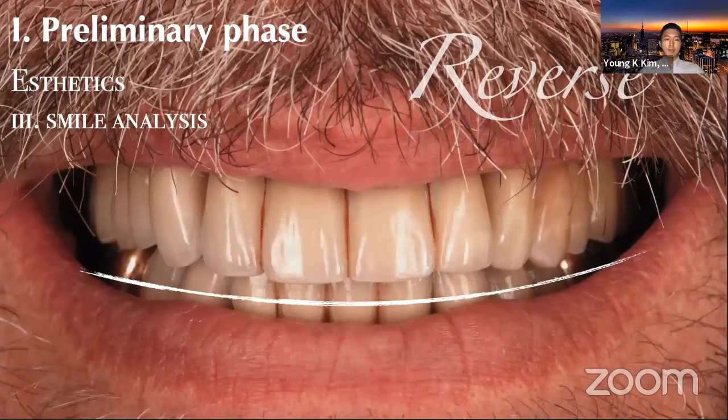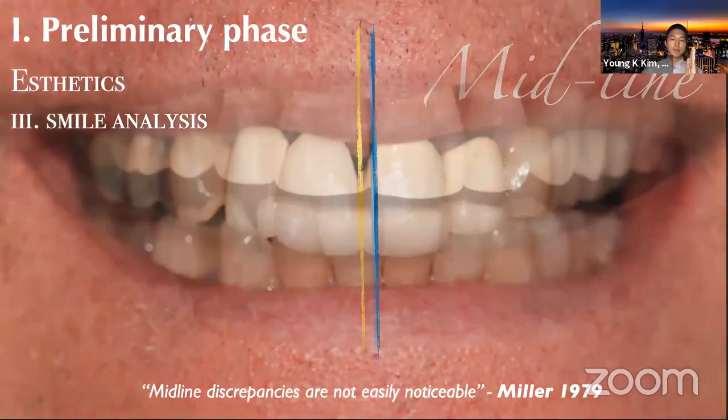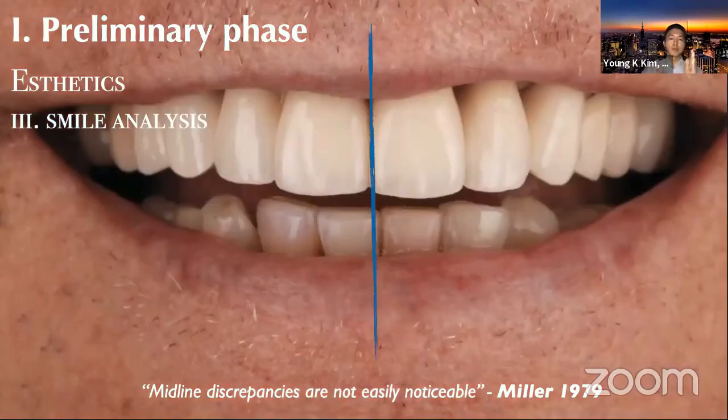What about the midline? It's well known that midline discrepancies are not easily noticeable. What I mean is, as a displacement type of midline, off midline, we can't really recognize it. In this photo, I put a line in between those two so you can appreciate the difference.